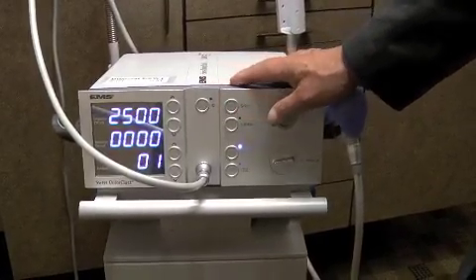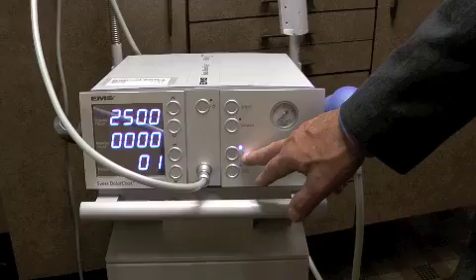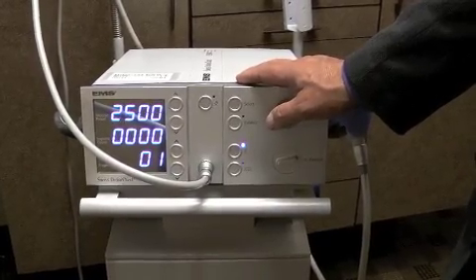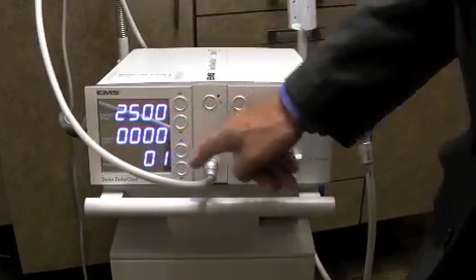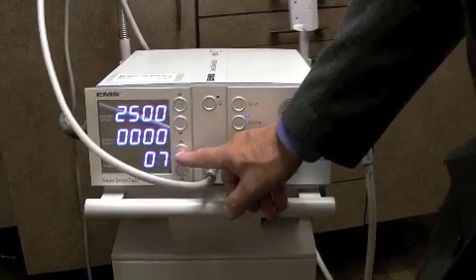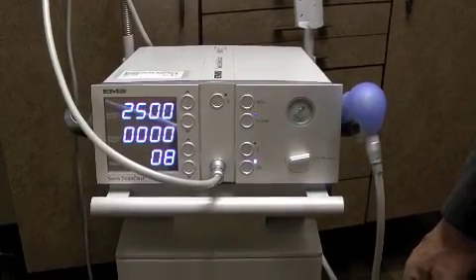The next one we want to look at is these little areas down here. When we see one little item sticking up here, that means that we're only going to give one shock at a time, but we want to give multiple frequencies. So we like to push this column right here somewhere between 8 and 9. So we're going to go up to that area. Somewhere between 8 and 9 is about the normal one. I'm going to put 8 on this particular time.